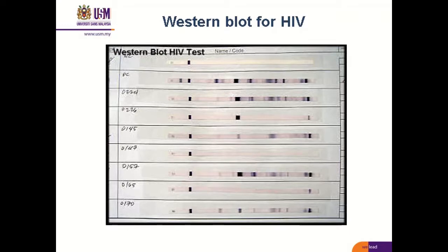If 2 or 3 are present, based on the criteria given by the test kit provider and the WHO guideline, we can diagnose it as HIV positive or negative.